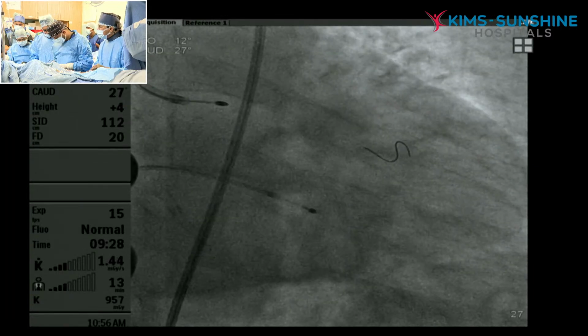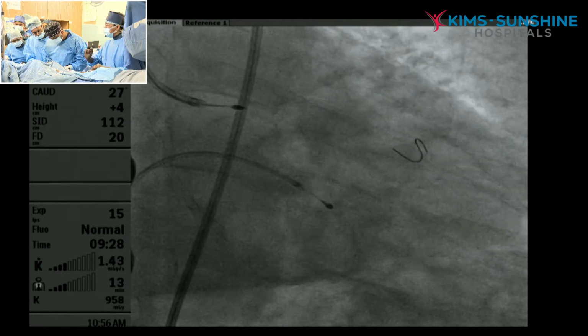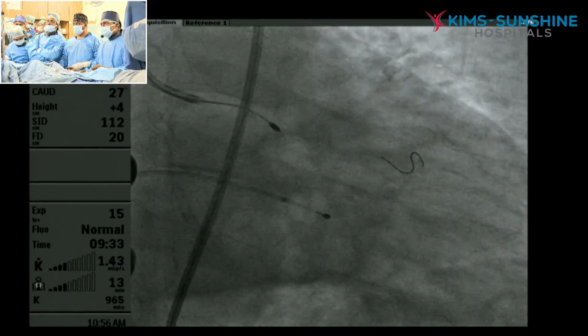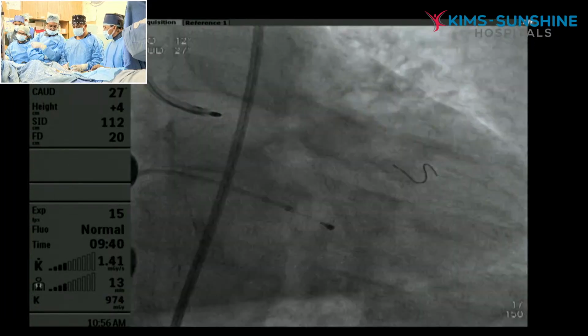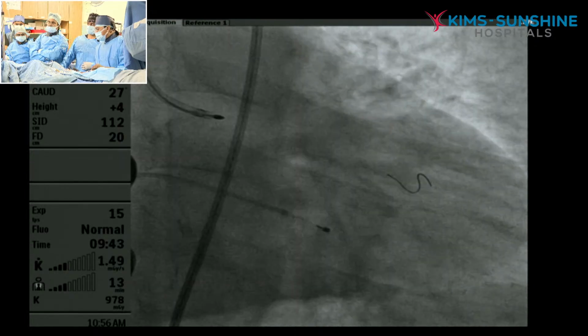This movement is not that free, I don't know. Brother, this movement is not that free. Compared to the previous rota, it was moving very fast, it suddenly jumped. We have already given enough gap. Dynaglide, you have to change it always, immediately you should change. We should not operate with our Dynaglide. Ready? Yes sir, ready.